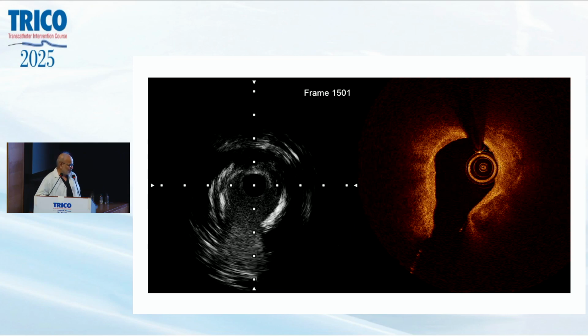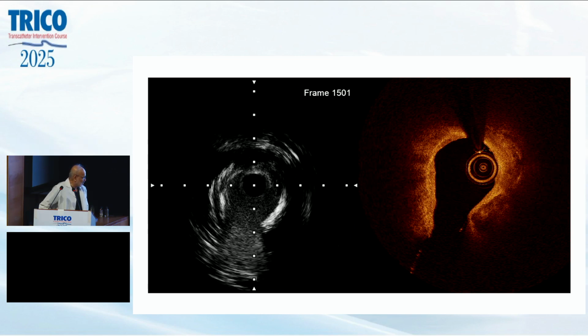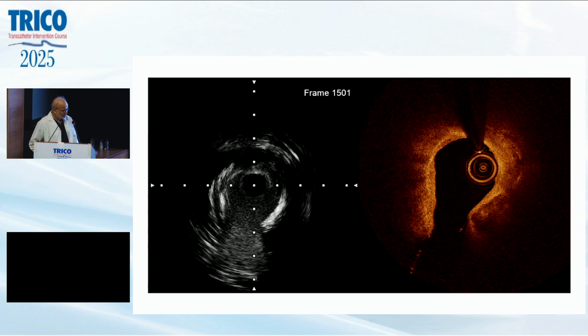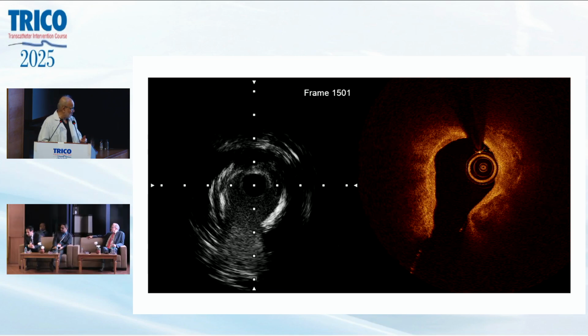And I think what's going to be helpful, at least what I'm looking forward to seeing, is what you learn about IVUS from OCT. Because you can look at the OCT and see so much. I think you can then go back and look at that IVUS, same section, and maybe learn more than we currently appreciate. So really excited to see that. And I totally agree. I hadn't thought about it scientifically, but it's a gut reaction when you see this big nodule at the carina. You know things are going to be scary for you. And if that shifts across from one branch to another, the outcome is going to be poor. And you're putting some science to it, and it makes sense. We don't have any evidence base, but yeah, this is what I feel.